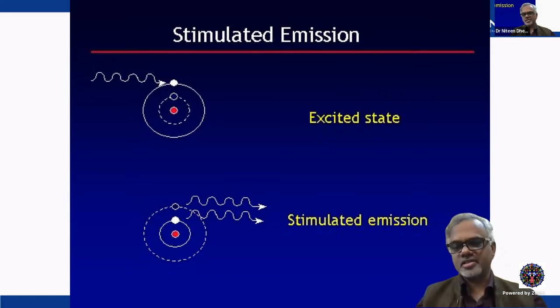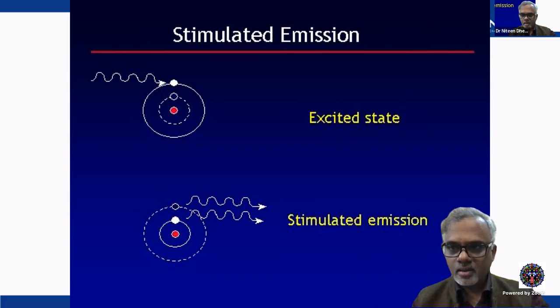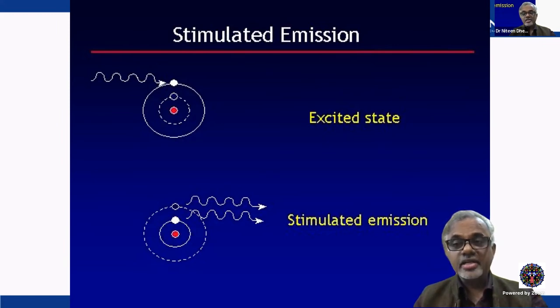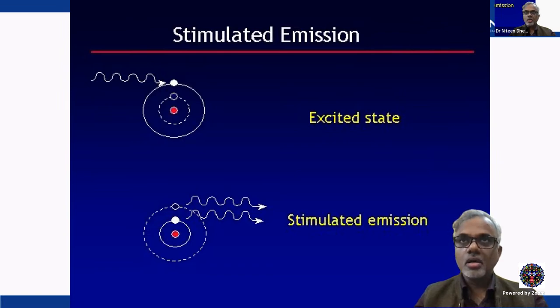Again, we'll rephrase this. This excitable atom or laser medium absorbs any packet of energy, that may be a photon of light of any wavelength, any color. It can be a packet of energy as a current, electricity. It can be a packet of energy through radio frequency. It can be a packet of energy in a chemical. And it throws out two photons of the same color.